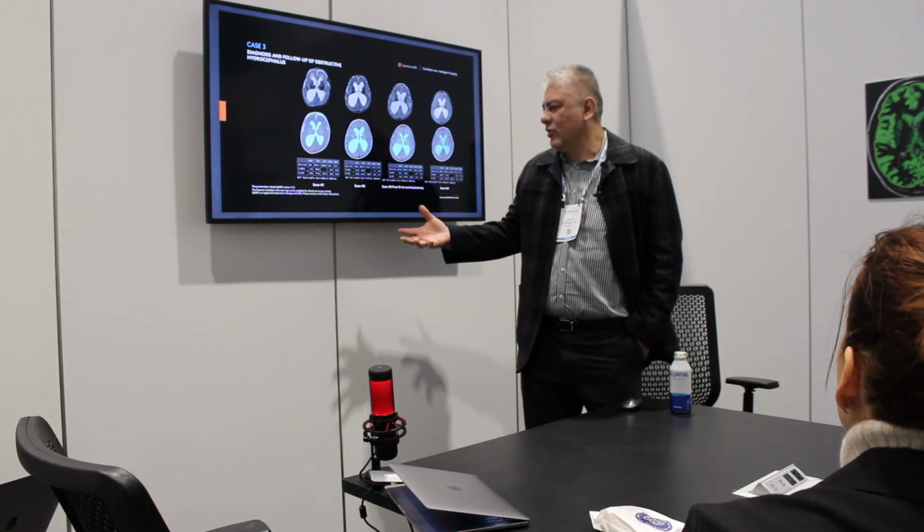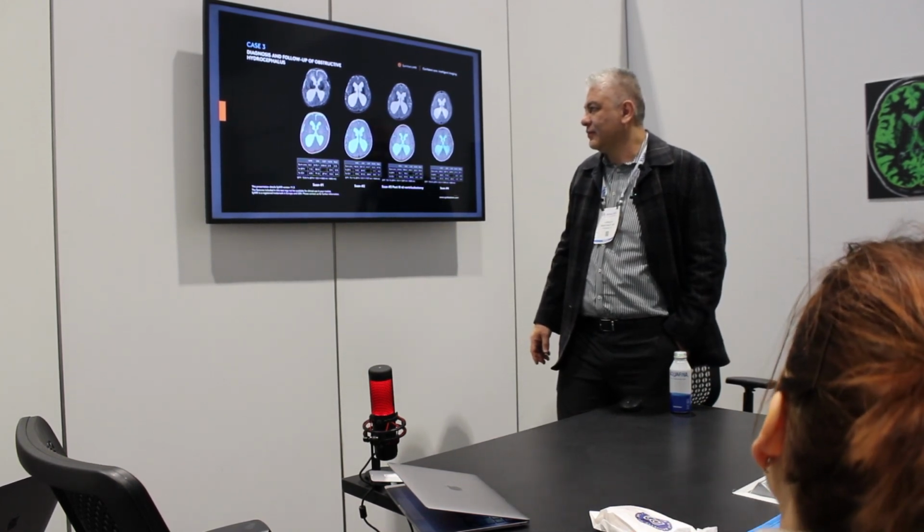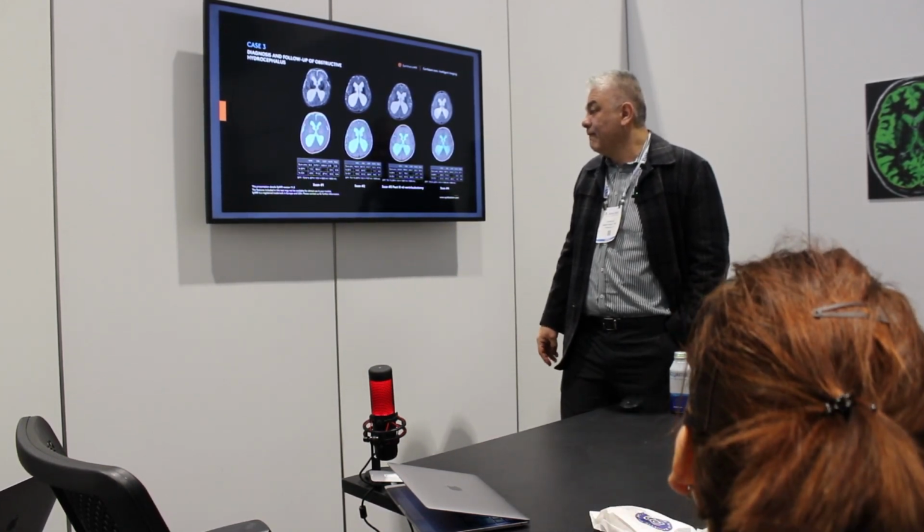This is where other volumes also help. I agree, because we don't know if it's due to growth or if it's due to taking out the fluid, right?